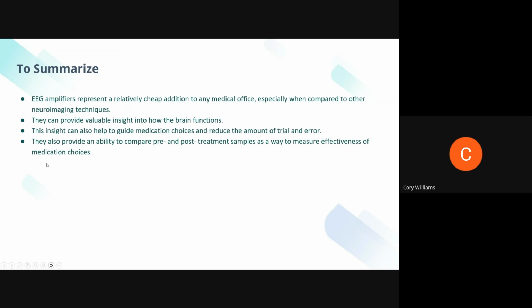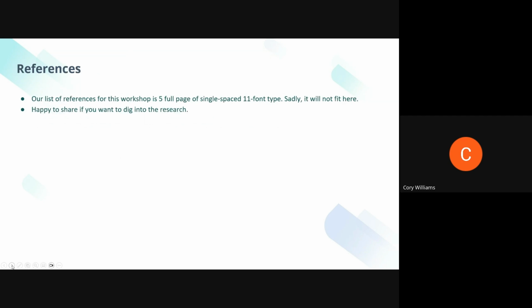And with an EEG machine, you get to show pre and post treatment. Even without doing neurofeedback, even if you're just doing medication, you can still do a pre and post EEG to show the effects that the medication has had on the brain. So I think it's a hugely useful tool, and I hope that this medication guide can help people implement EEG into their practice a little more.